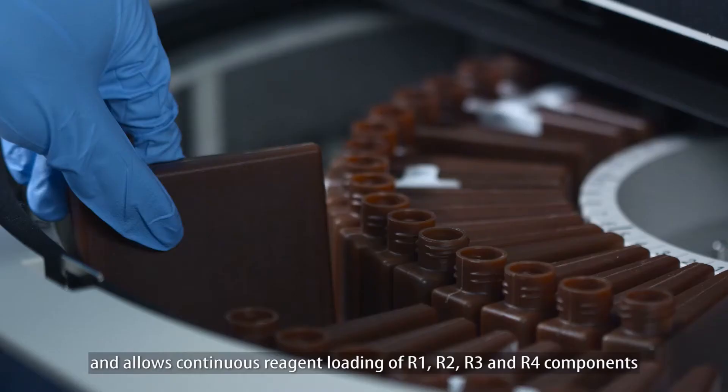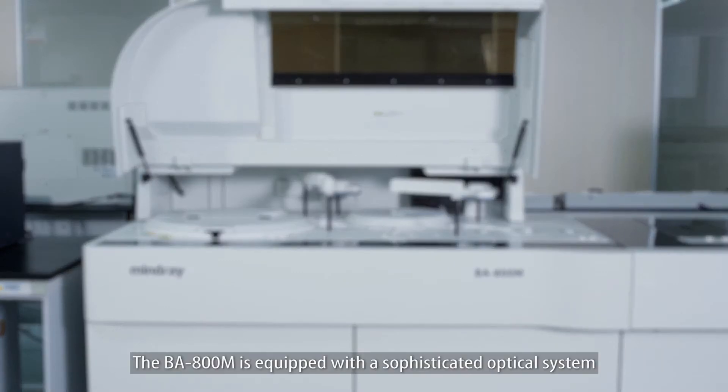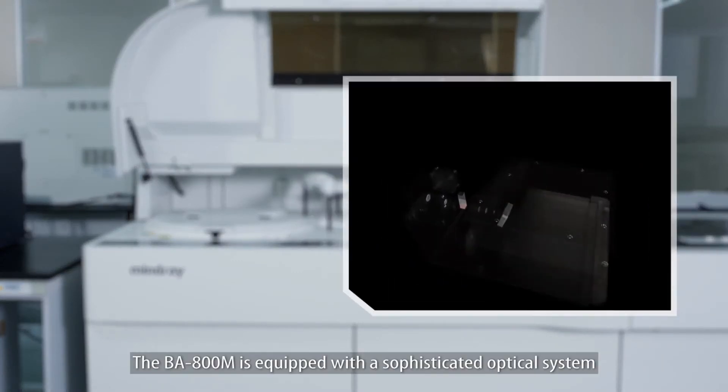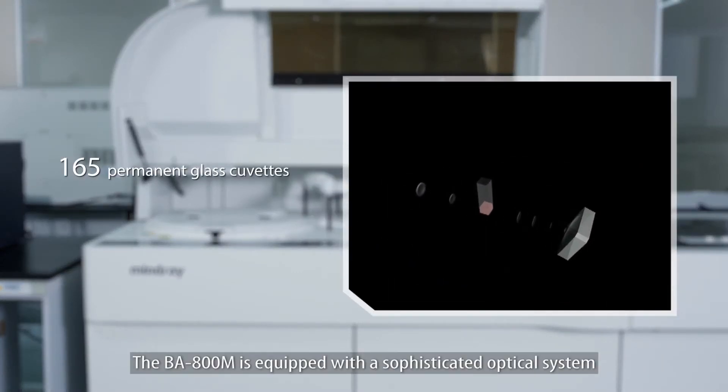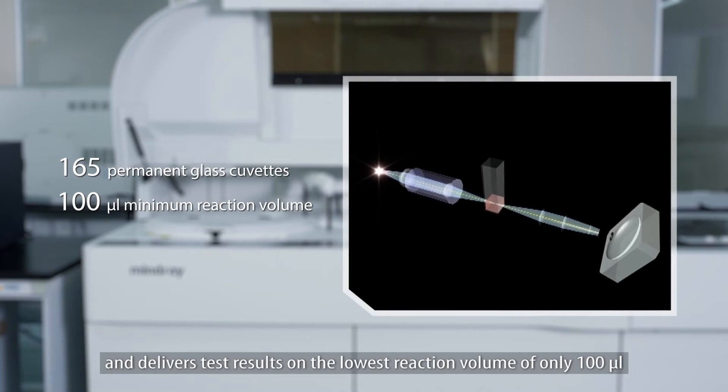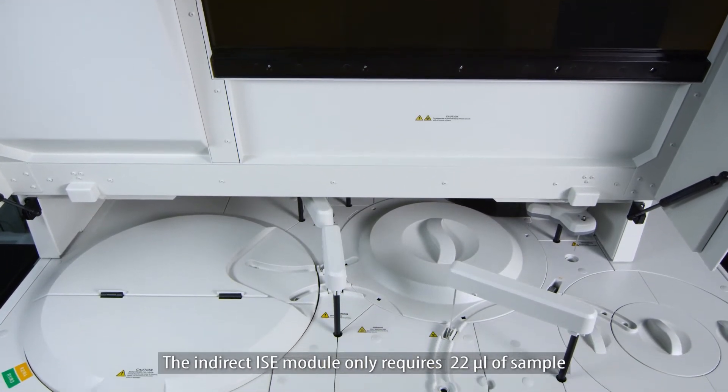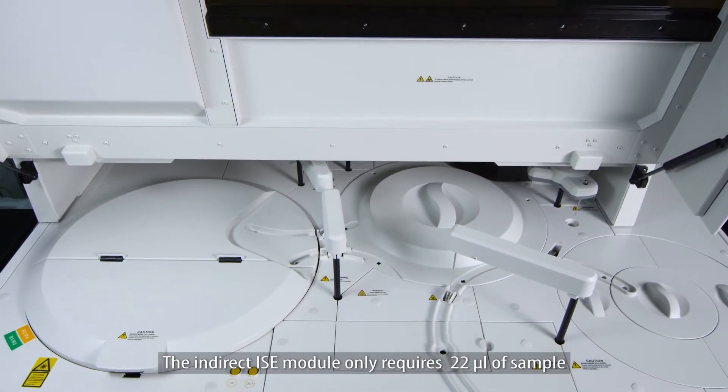The BA800M is equipped with a sophisticated optical system. The reaction disc includes 165 permanent glass cuvettes and delivers test results on the lowest reaction volume of only 100 µL. The indirect ISE module only requires 22 µL of sample.